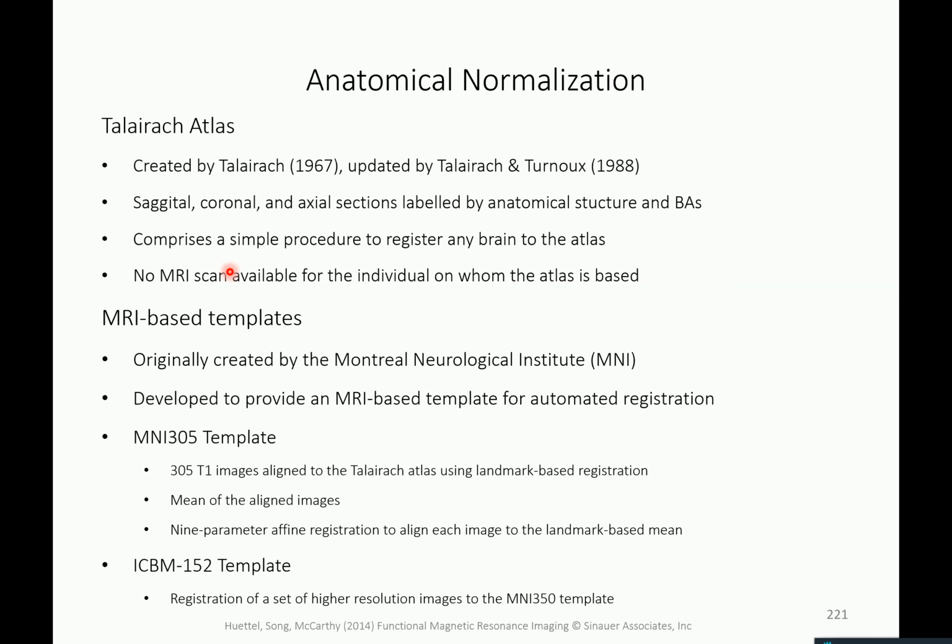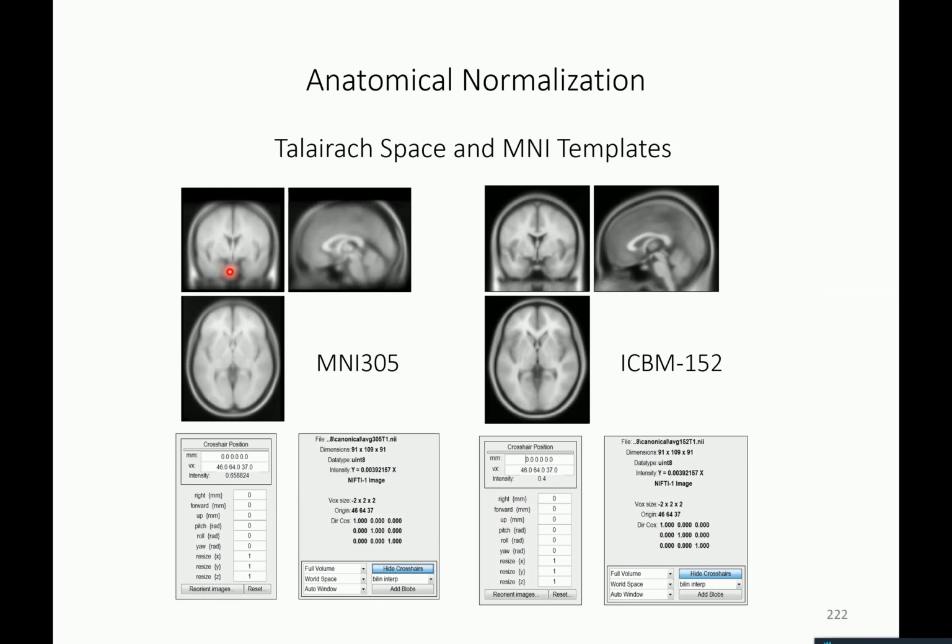And there's another template, the ICBM 152 template, which is a higher resolution than the MNI 305. So this actually shows the images.